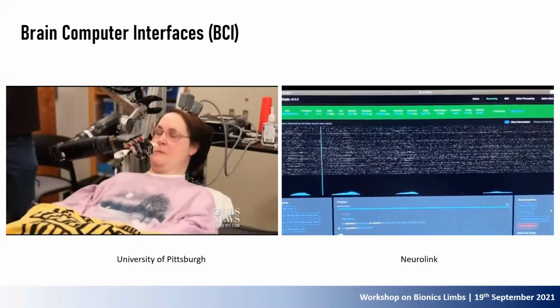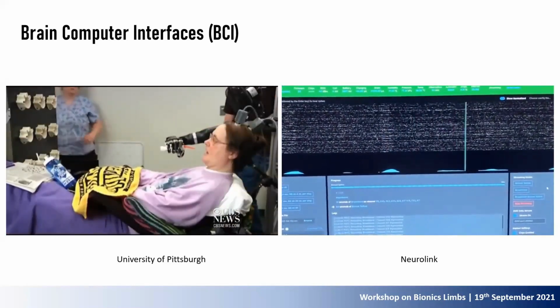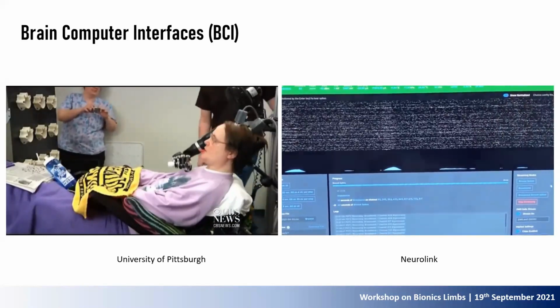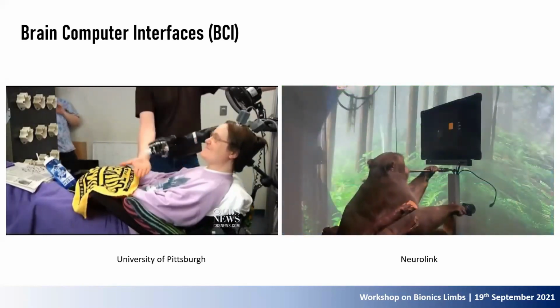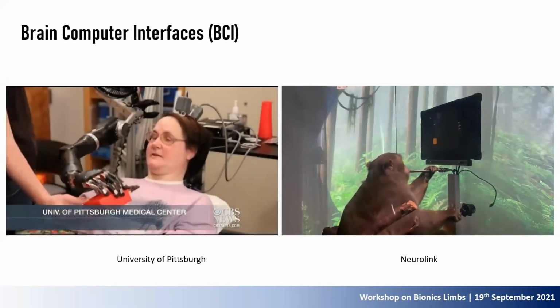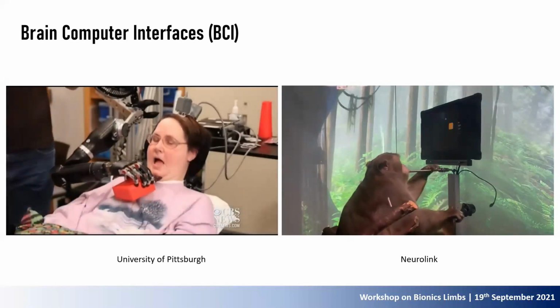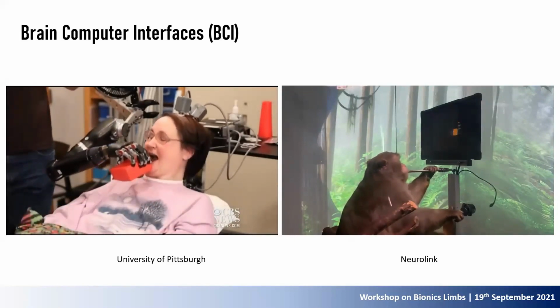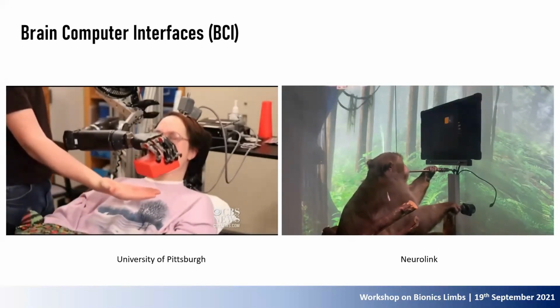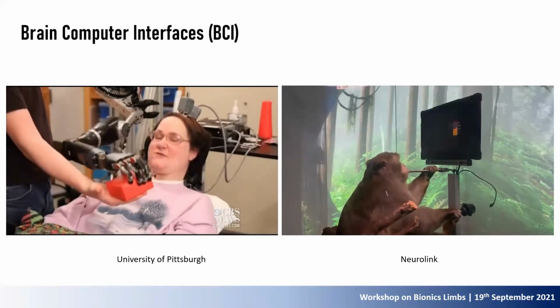Using these signals, we calibrate the decoder by mathematically modeling the relationship between patterns of this neural activity and the different joystick movements it produces. After only a few minutes of calibration, we can use the output from the decoder to move the cursor instead of the joystick. Pager basically still moves the joystick out of habit, but as you can see, the joystick is unplugged, and the monkey is controlling the cursor entirely with decoded neural activity.